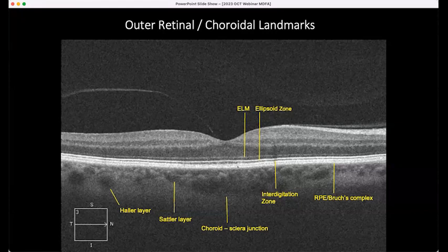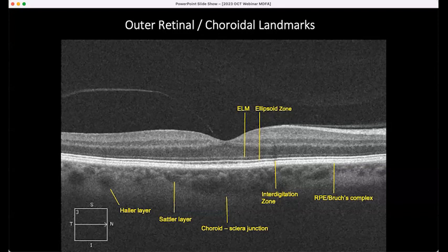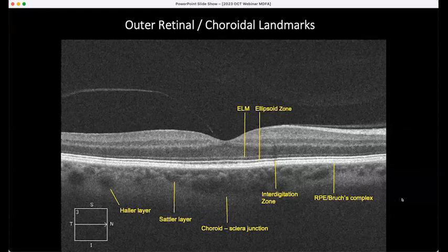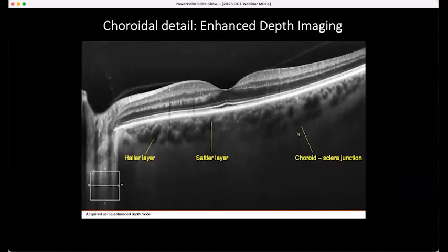You can't normally see Bruch's membrane because it's so thin and adherent to the RPE, but you can see it if the RPE is either absent or detached. Then you can see the Sattler layer — the smaller vessels — Haller layer with the larger vessels, and the choroid-sclera junction, which is much better seen on an EDI or enhanced depth imaging scan.